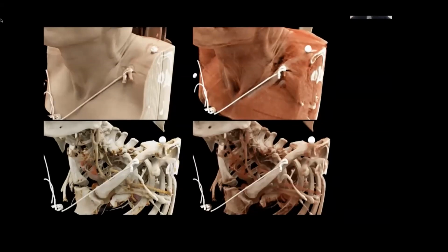So the short answer after all of that is to say that, yes, I think overall this is an accurate representation of the anatomic structures, but I think you do have to be aware of the fact that there have been several layers of processing, and that the layers of processing are dependent on individual decisions as to how they want to depict various structures. Did that answer your question?